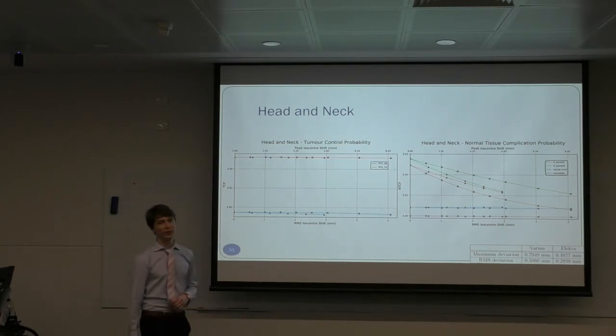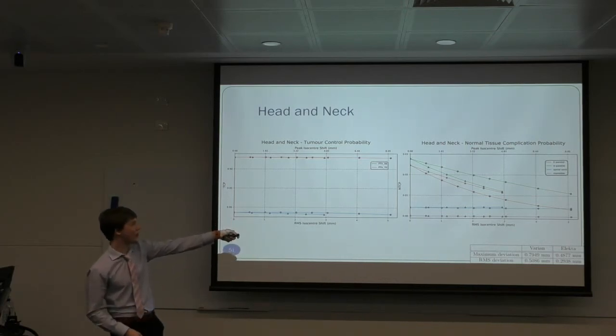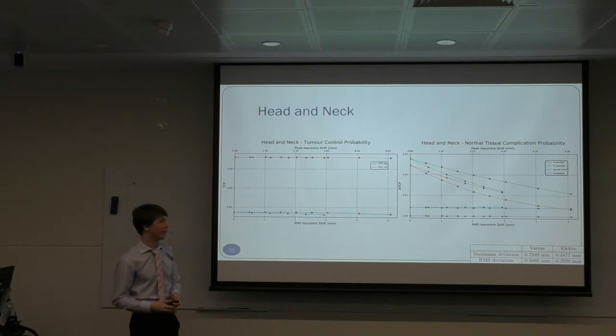First of all, maybe the treatment planning system, in creating this plan, didn't care so much about these organs because we're already very low on this axis, already close to 0, and maybe it was focusing on optimizing other things like conformality of the planning target volume, and it considered a better treatment as one with maybe slightly higher NTCP for the parotid glands, but better uniformity.